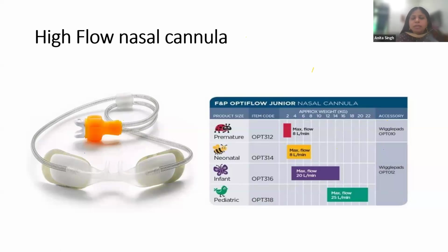So why is this 50% there? Because you have to give a way for exhalation of gases. In case of CPAP, we will discuss that there is an exhalation limb, while this is not so in case of the heated humidified high flow nasal cannula system. The inspiratory gas goes through the nasal prongs, and exhalation has to occur by the side of the prongs. So this has to occlude up to 50% of the nasal aperture for the HHFNC, and that's why there is a leak.